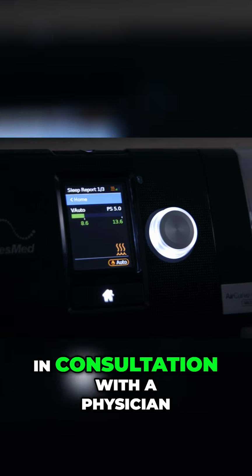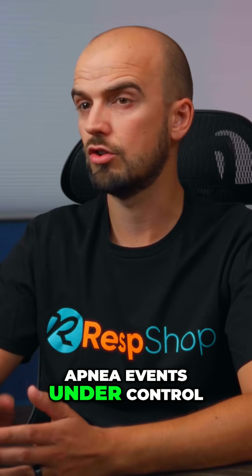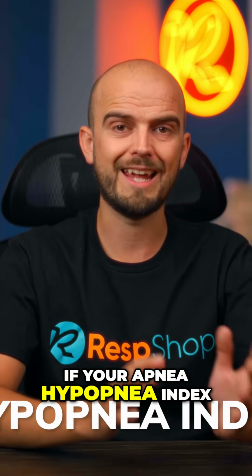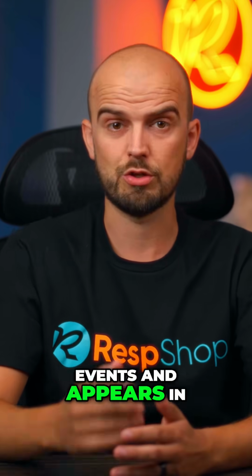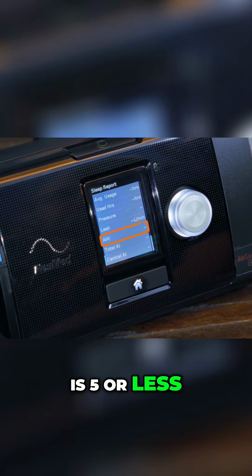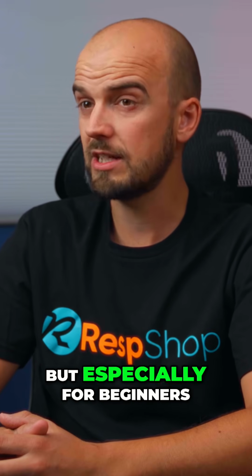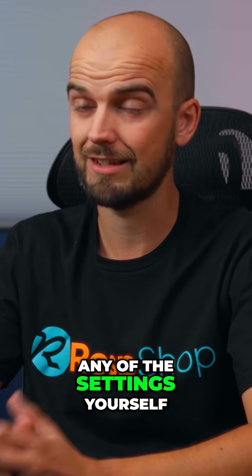This should be done in consultation with a physician, but a general principle is to keep your apnea events under control at the lowest pressure possible. If your apnea-hypopnea index, or AHI, which measures your apnea events and appears in your sleep data, is 5 or less, it should be fine to reduce the pressure settings just a little. But especially for beginners, talk to your doctor about that before adjusting any of these settings yourself.